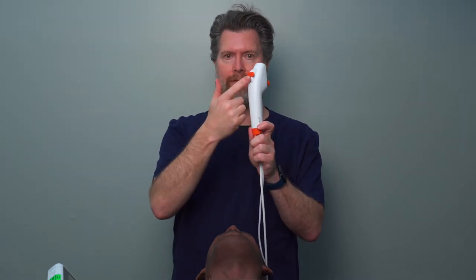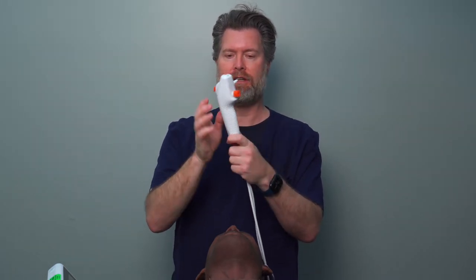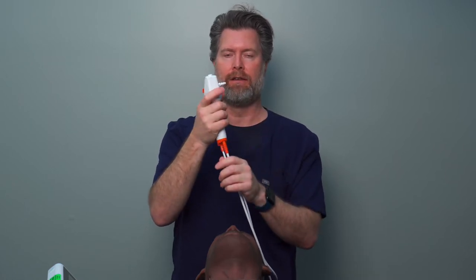Let's take a look at the scope itself. It's got the handle, the lever for driving the tip, and suction here. The suction catheter is attached here. You should put your index finger on this part and your thumb bent lightly on the lever. When you're driving the scope, you press up to go down and down to go up. Those are the basic movements. Soft movements usually produce enough — you don't have to really yank it, because if you do, it goes 180 degrees, which is not helpful. Probably no more than 20 or 30 degrees is ever needed.